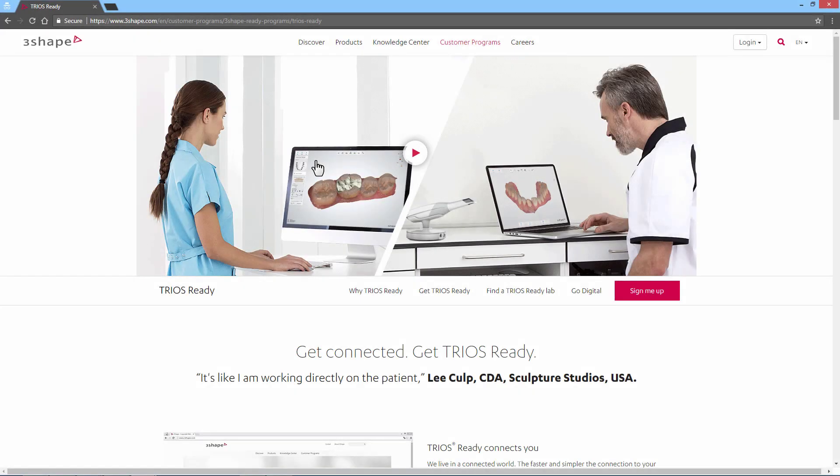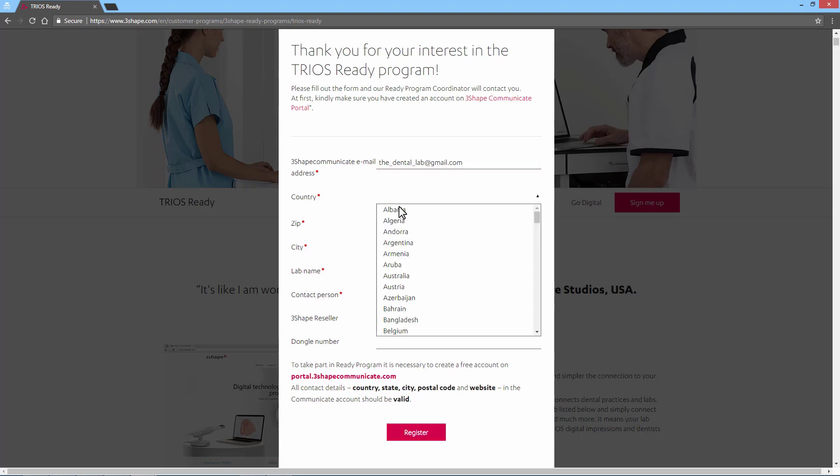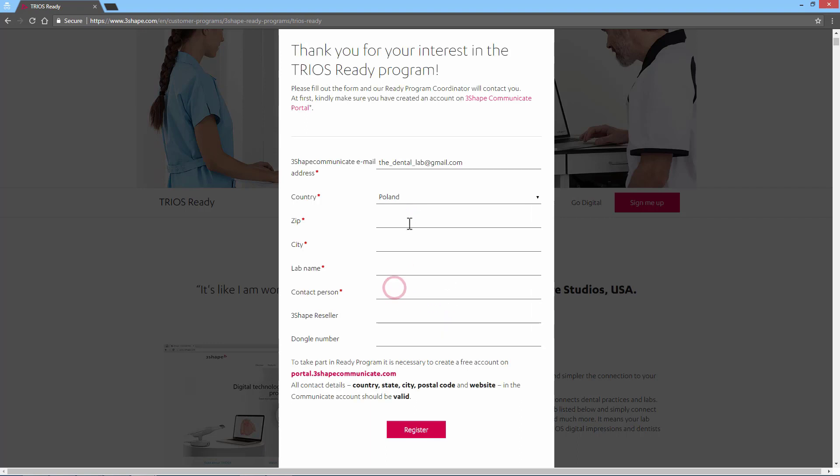To sign up for the TRIOS Ready program, click the Sign me up button, then fill in all the necessary details. Please remember that you need to have an activated 3Shape Communicate account to sign up for the TRIOS Ready program. It is important that you register the correct email address, as this is the address we will send your TRIOS test case to, and the email address 3Shape will promote to TRIOS users once you have completed the TRIOS Ready program.